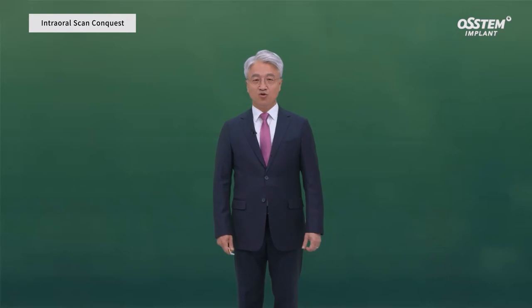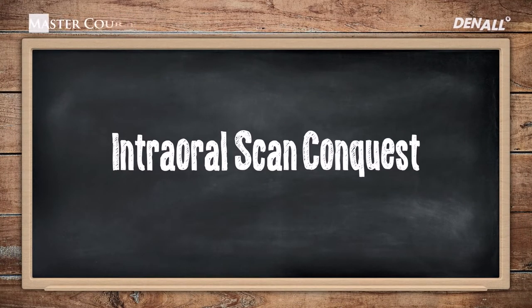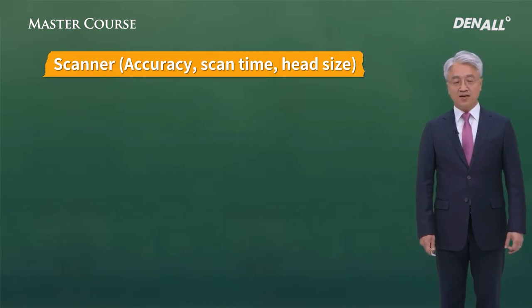Today, I'm going to talk about how intraoral scanner can help our clinical practice. The biggest requirement with intraoral scanner is precision. The scan time needs to be short, and because it goes into patient's oral cavity, the head size needs to be small.